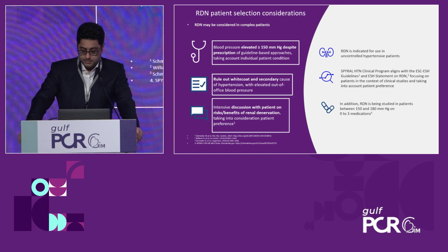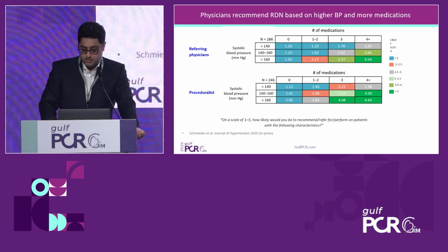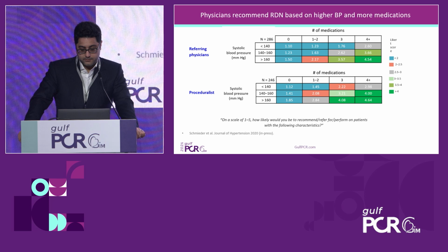Just quickly, based on the guidelines, and we've discussed this, the guidelines have now included a 2B recommendation for RDN based on recent studies and the effectiveness of the therapy. This is basically a physician recommended.